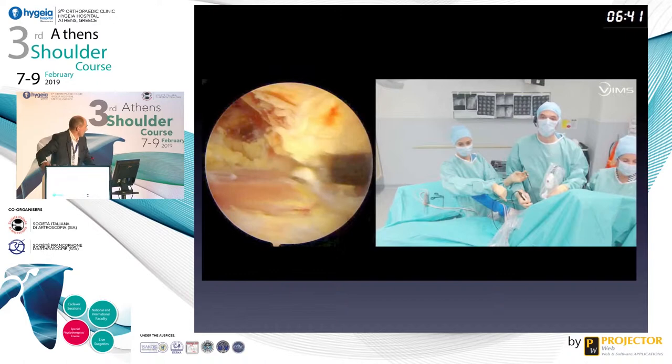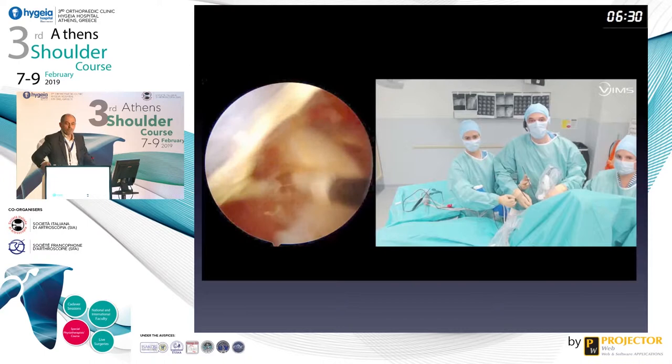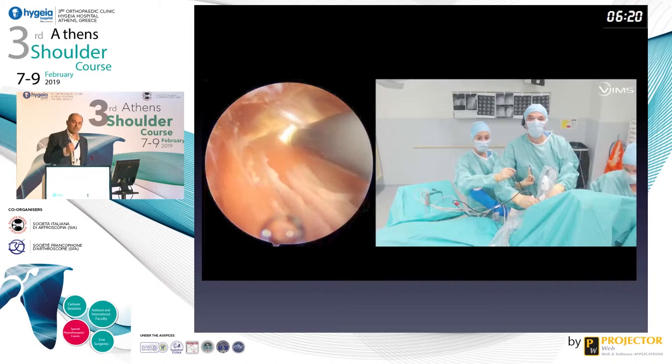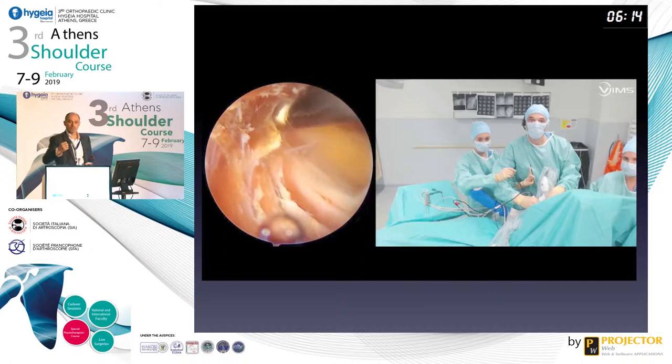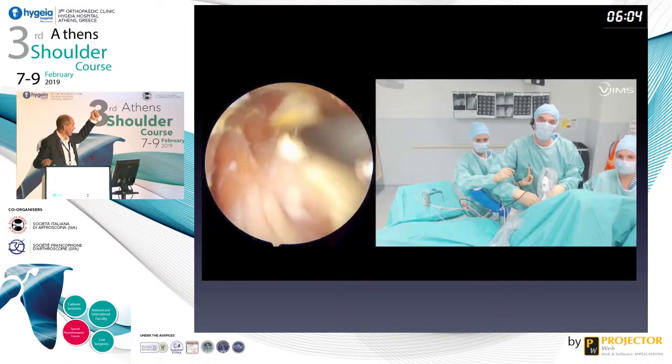And then you continue the dissection. The red muscle is, of course, still the teres major, and you can see all this connection. The anatomists call this the aponeurosis of the long head of the triceps. So now you continue, and on the right you have the lat dorsi, and I forgot to say that with your suture you can pull up your tendon, and you can mobilize the tendon from back, from inferior or from superior, and then you can continue. The two sutures are up. I pull up my lat dorsi through the skin, and it's very easy to continue the progression in between.